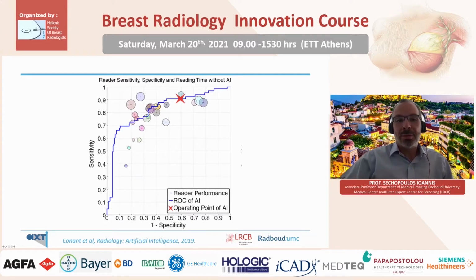So in summary, how do we implement tomosynthesis-based population screening? Well, perhaps we need to look at only one view per breast, do only a single reading of each case, maybe reduce the slices to slabs and end up with only 5 to 10 slabs per view.